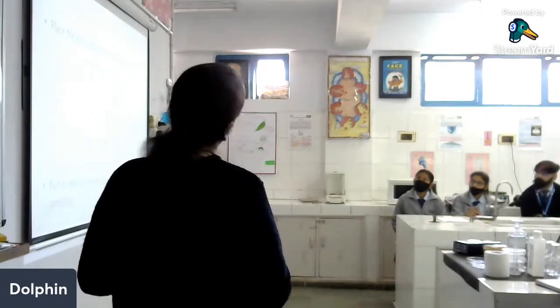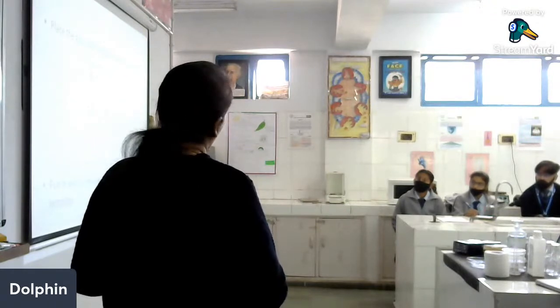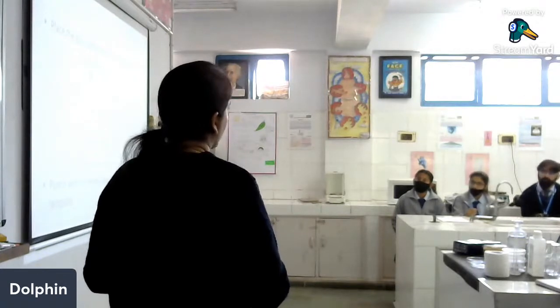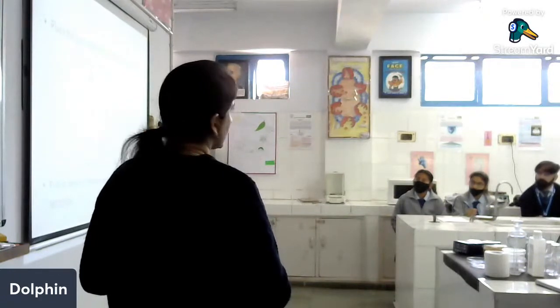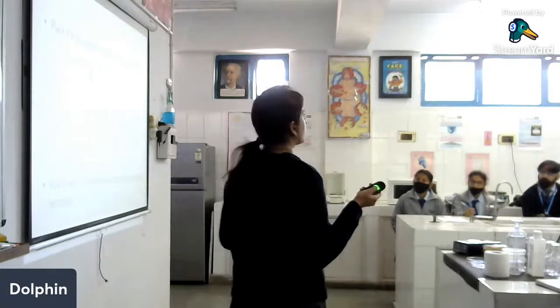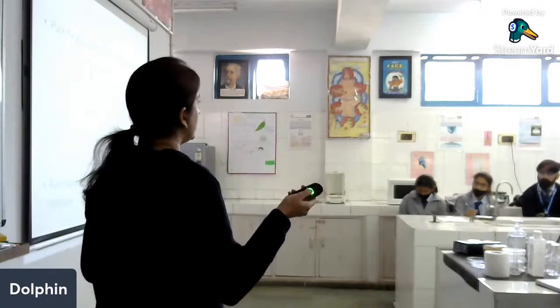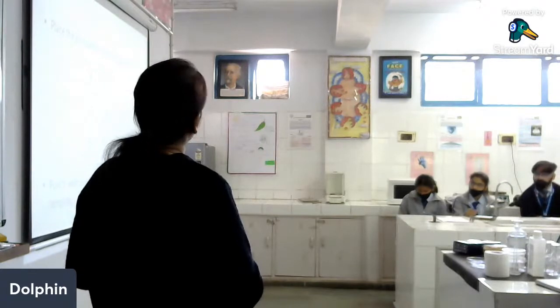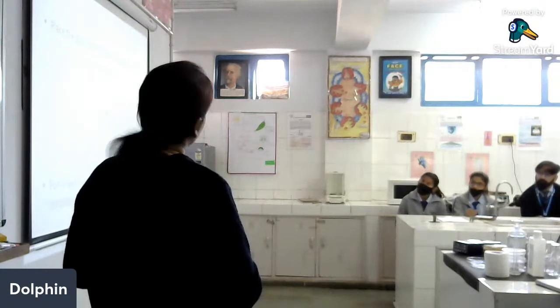What we do is, we place this glass plate on the template. The template is a paper on which there will be markings. These markings show where you have to put the standard sample and where you have to put the test sample. Today there are four standards, A, B, C, D. The concentration will range from 3.75 to 30 milligrams per ml: 3.75, then 7.5, then 15, and then 30. So known concentrations we will load in the A, B, C and D wells. There are two test samples given, so we will load them in E and F.